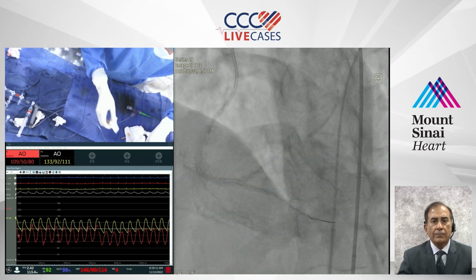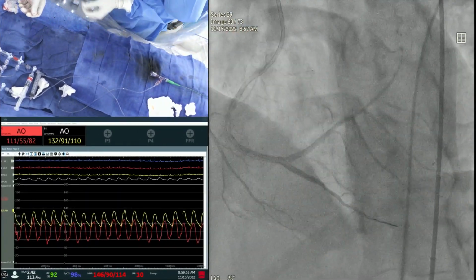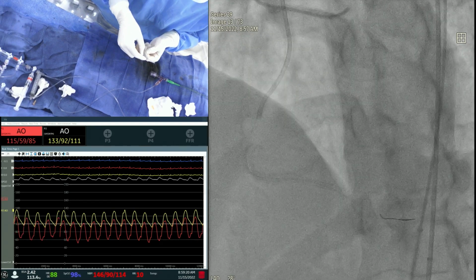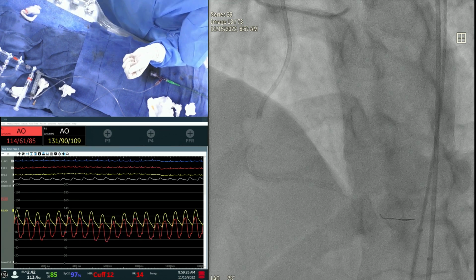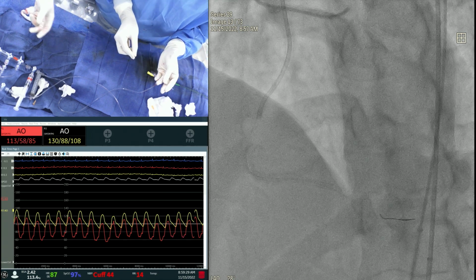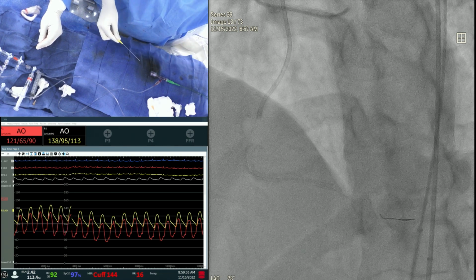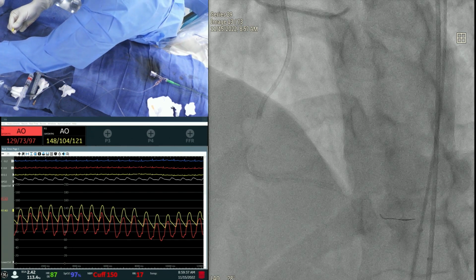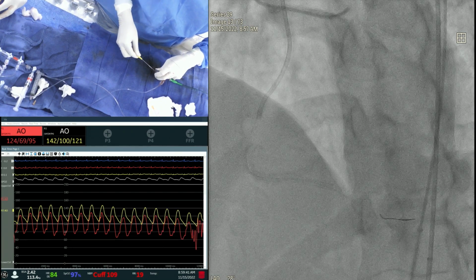You needed it, but once you have such a diffuse dissection, yeah. Look, 37-year-old, we need to get absolutely the best result possible. Beautiful, yes. We can use the 12, same one. We go with that first and then we have a 2.5 actually. We can go 15, 2.5 also. High pressure. Yeah, 2.5 high pressure. That we have, 2.5, 15 or 20. No, we don't have non-compliant.